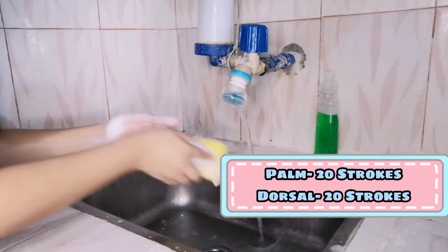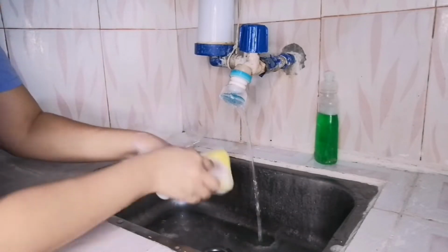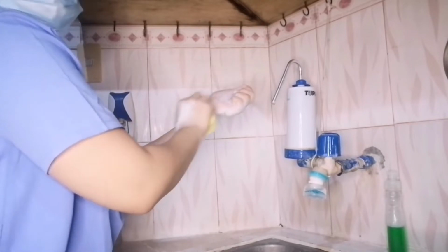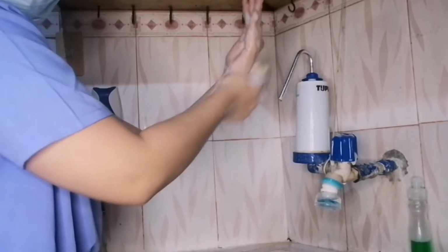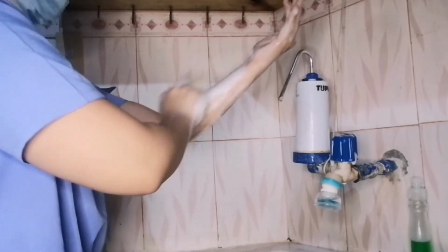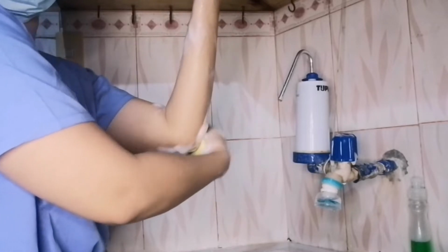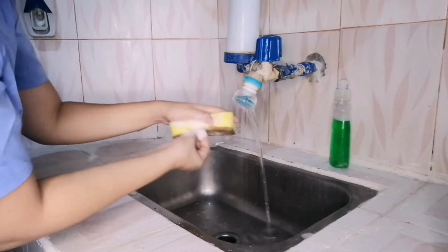Scrub the dorsal and palm surfaces of the hand and wrist with a circular motion. Starting at the wrist, scrub all four sides of the arm to the elbow. Transfer the scrub brush to the other hand and repeat steps 6 to 8.